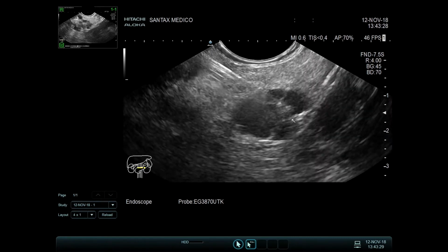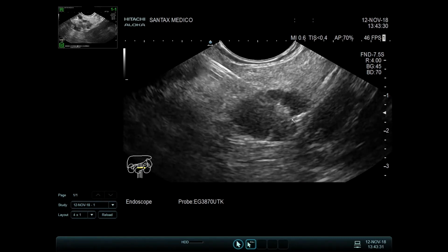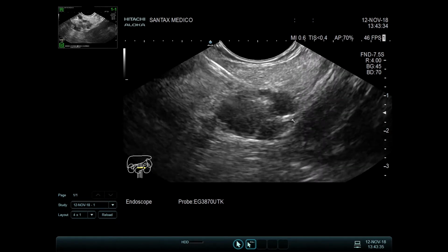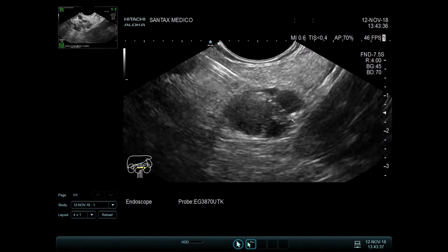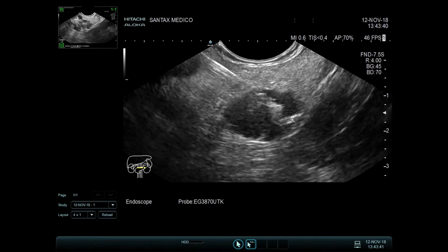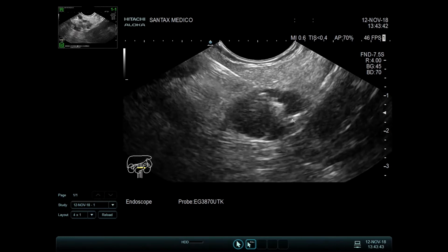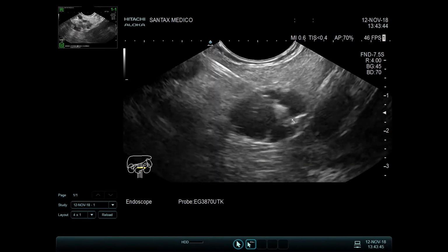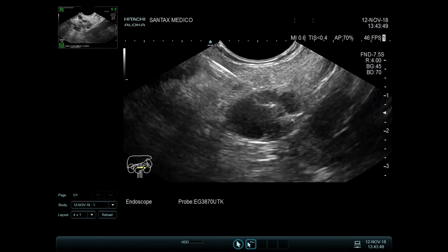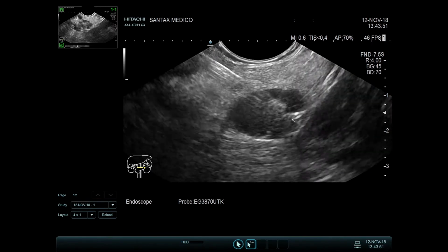Close. Not satisfied. I retract the needle tip a little bit. It might be stuck on open. There you saw it opening, and put a little pressure on close. Yeah, that was better. Could you retract it?